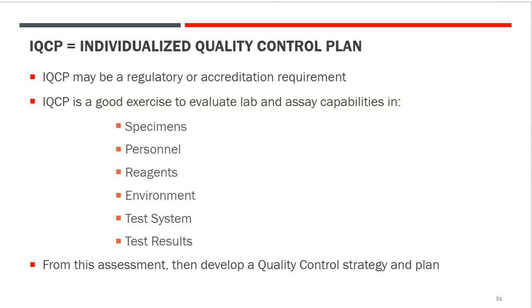The other thing we're going to mention a few times is IQCP, the Individualized Quality Control Plan. This is a very useful tool. It's outlined in the CLSI EP23 document that began this section. In many places, it is a regulatory and/or accreditation requirement. And it's a good exercise to evaluate your laboratory and your assay capability in terms of these 6 bullets here.